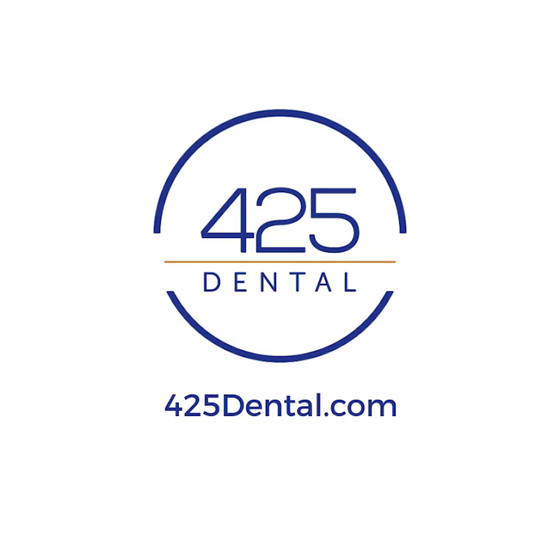Let's get started. Aligners must be worn 22 to 23 hours daily. It is imperative that you follow the guidelines that Dr. Olick has specifically planned for your treatment in order to see the best results from Invisalign. If the aligners are not worn properly, your teeth will start to shift back into their original positions and will not be on track with the projected outcome.